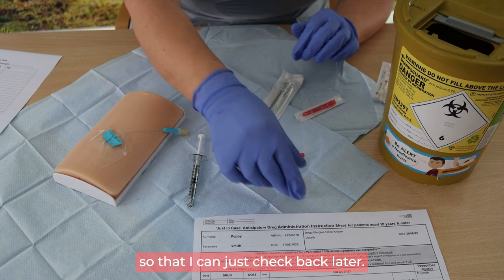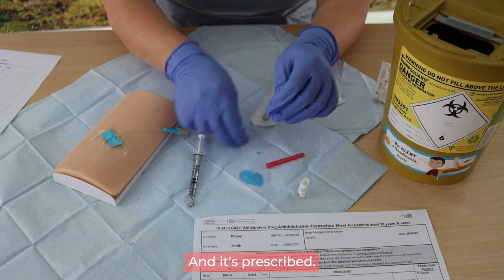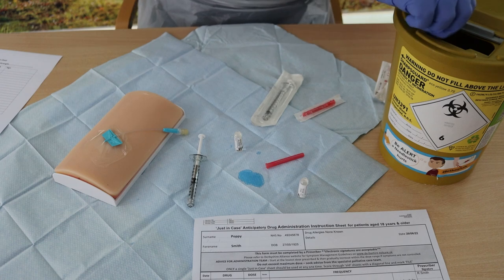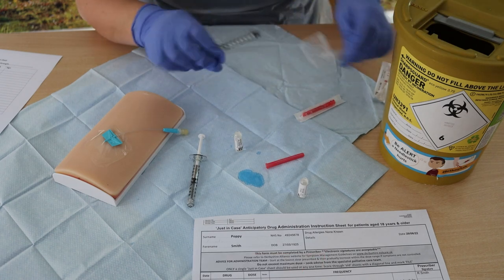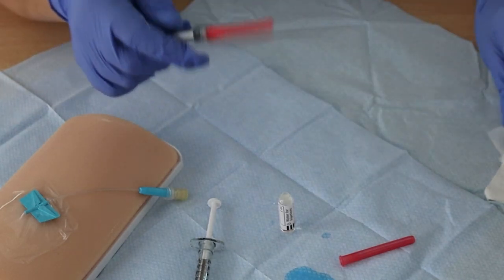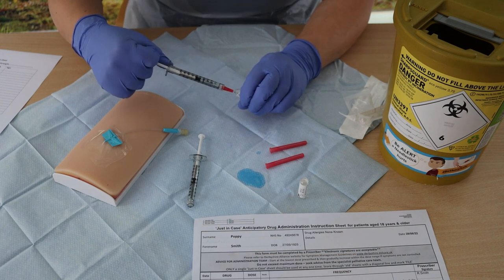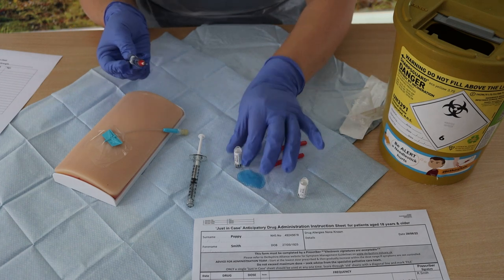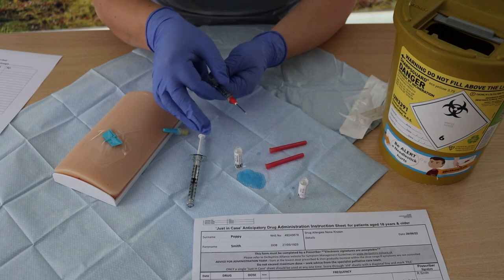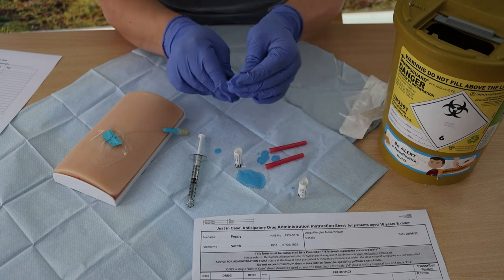I'm going to keep my vial so that I can check back later. Then I'm going to prepare a flush, which is water for injection. Checking my batch number and expiry date, which is all OK and it's prescribed. I'll get a second syringe and a clean filter needle and draw up some water for injection for a flush after administering the medication, just getting rid of any air.